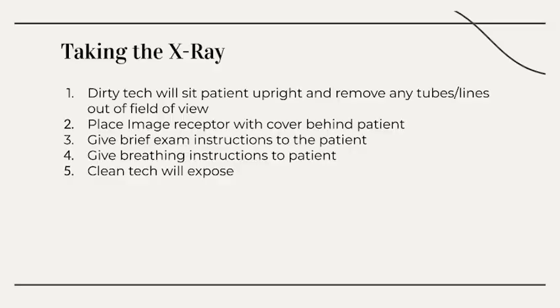Taking the X-ray. Dirty tech will sit patient upright and remove any tubes or lines out of the field of view. Dirty tech will place the image receptor with cover behind the patient. They will give brief exam instructions to the patient. They will give breathing instructions to the patient. The clean tech will expose on the patient's inspiration.